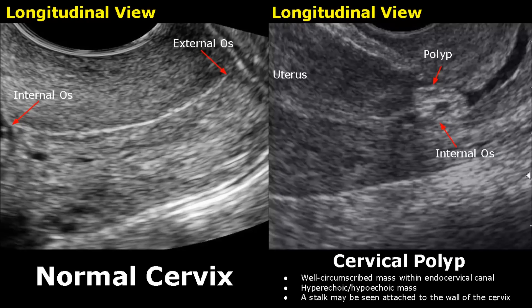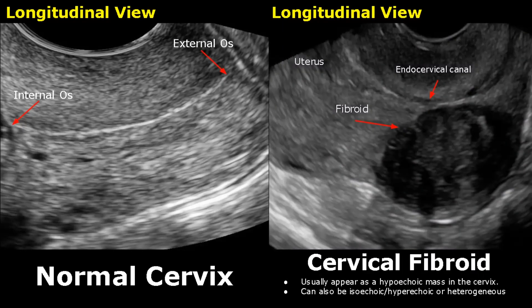A fibroid can also be found in the cervix. It will appear hypoechoic mostly, but it can also appear isoechoic or hyperechoic and even heterogeneous.